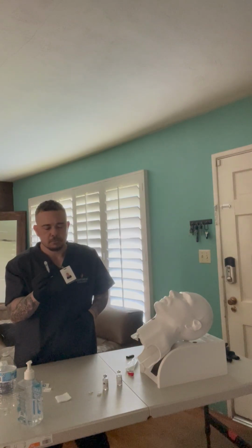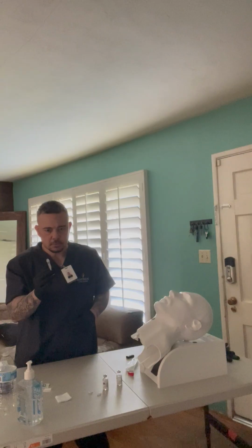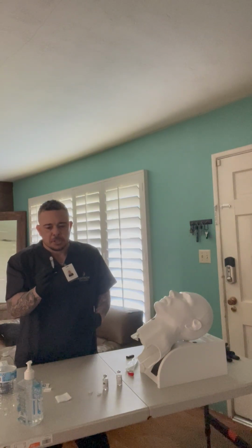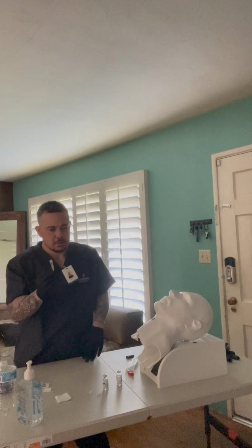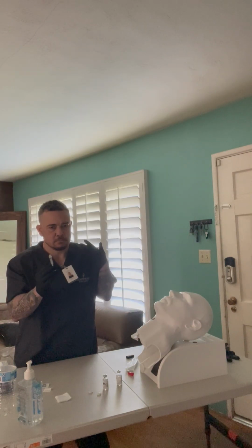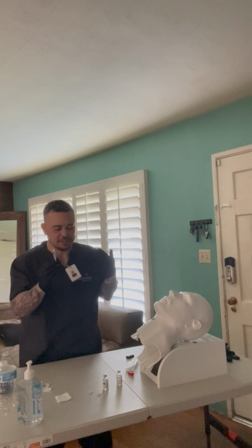I have to make sure of the combined dose. So I have 4 units of the regular insulin. I want to check that against the EHR and the MAR to make sure this is the correct dose.